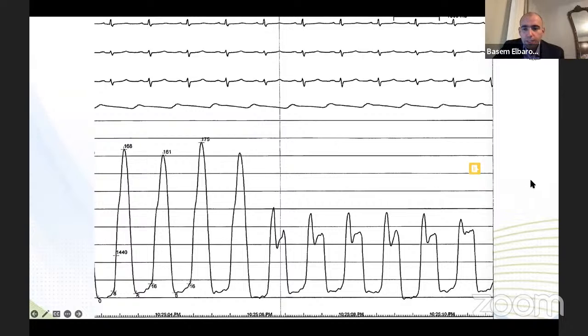Now, this is a real case, my measurements here, not the cath lab. So someone said mixed disease. Good thought. Aortic stenosis, severe AS. So there is a severe gradient, but the gradient is not between the left ventricle. Yeah, Dr. Bahilil, dynamic obstruction. Excellent. So the gradient is not between the left ventricle and the aorta.